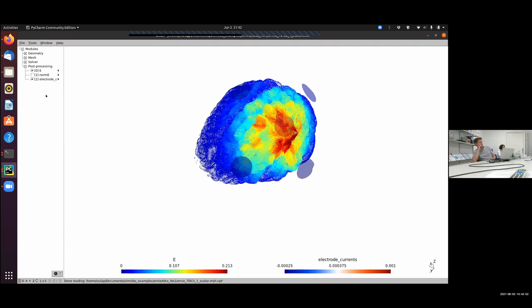But then to simulate a directionality effect, that would be more a causal neural model, for example, of causal connections, which is a very different way of modeling. It's a high level model of how different areas of the cortex interact. What you could then inform this model with is the strength of the stimulation from the SimNIBS field. That's something you would then do there.